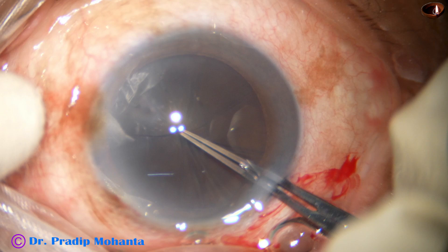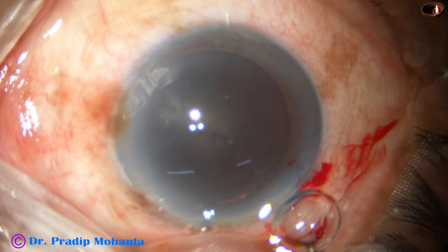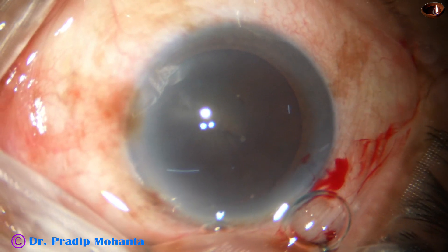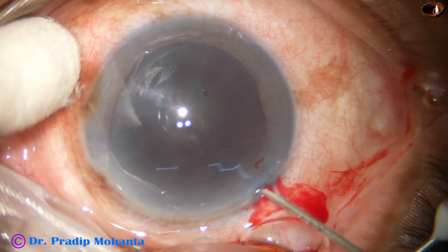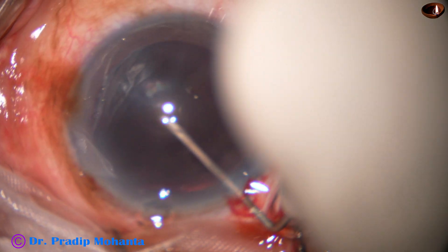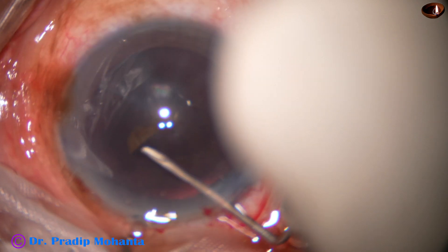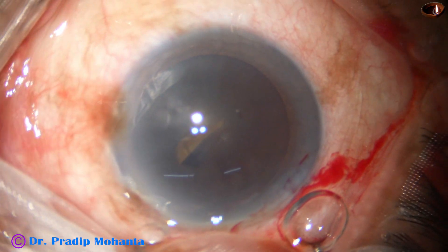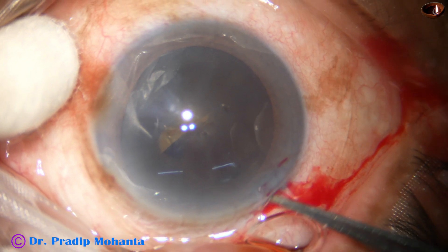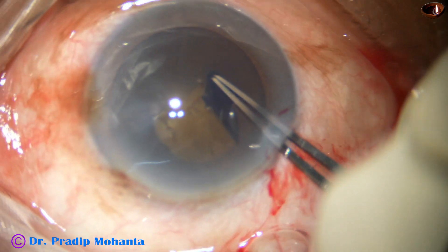Now see, I cannot pierce the anterior capsule with the tip of the utrata forceps and there is wrinkling and radial spoke-like sign. It means the zonule is very weak and I need to use a sharp needle and cut the capsule. Even with this sharp needle, the whole lens — the capsule nuclear mass — moves, meaning generalized weakness of the zonule.